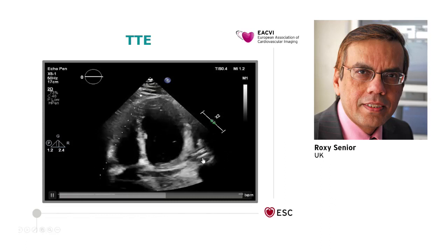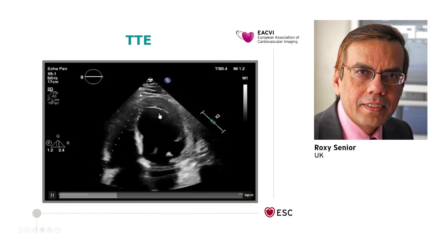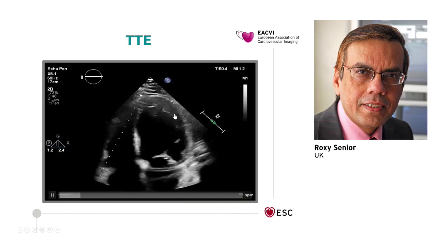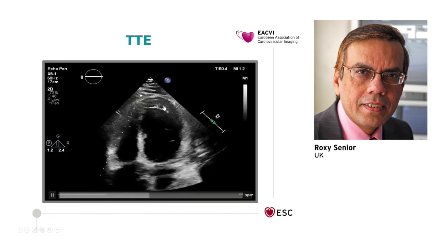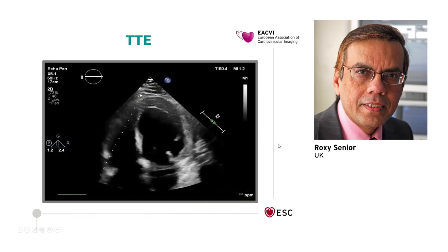Now here, the transthoracic echo looks pretty good, meaning the images are good, but the heart is not good. You can see the LV is dilated and severely globally hypokinetic. The RV is dilated and severely globally hypokinetic. So it's a biventricular dysfunction. But what we were worried about is at the apex, there looks to be something there, quite a thick apex. Because of high thrombogenicity in this population, we need to know whether the patient has a thrombus at the top. So we injected contrast here.